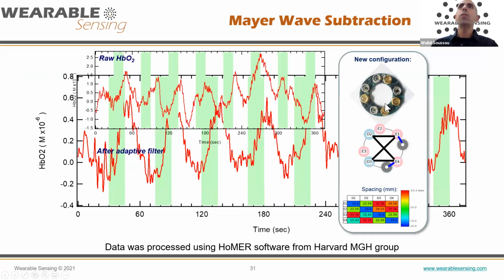So having an array of electrodes allows us to do this at each site immediately. So it's a built-in feature. We have an emitter and a detector near each other, so we can get this short distance path, and then we can also get lots of long distance paths. That also allows us to select the optimal path. If the longest distance path isn't bright enough, we can choose a second one. If neither of them are fine, we can choose a slightly shorter path. So there are several paths in each electrode that we'll be able to select.